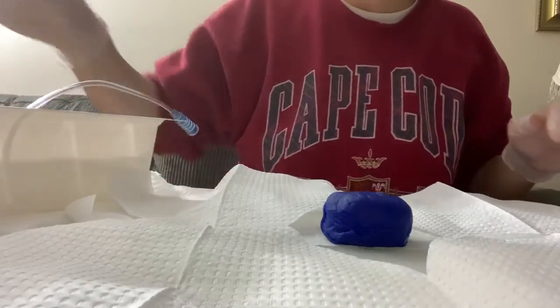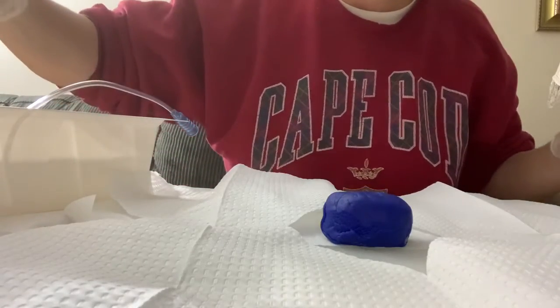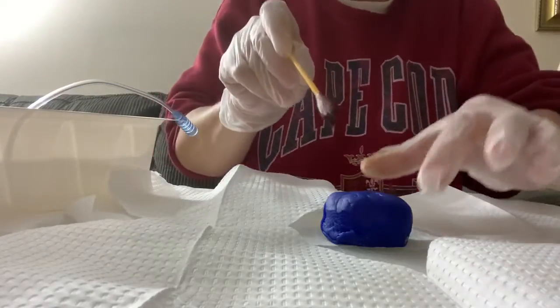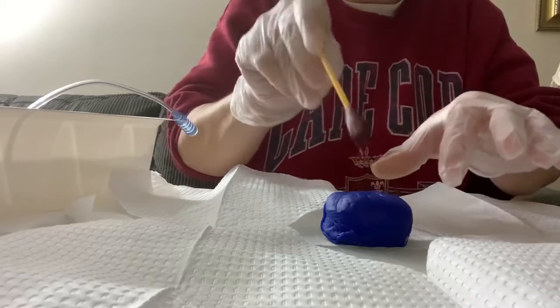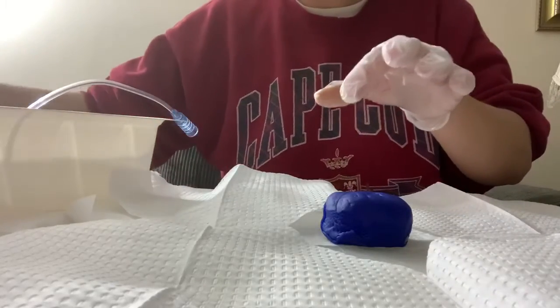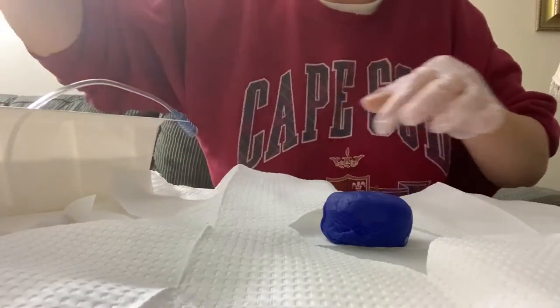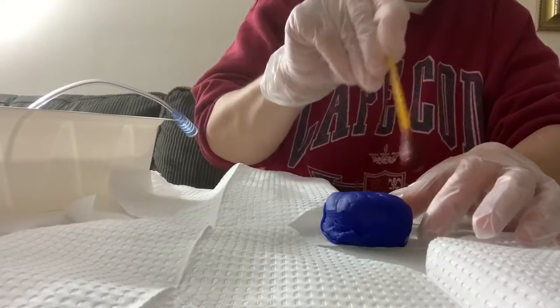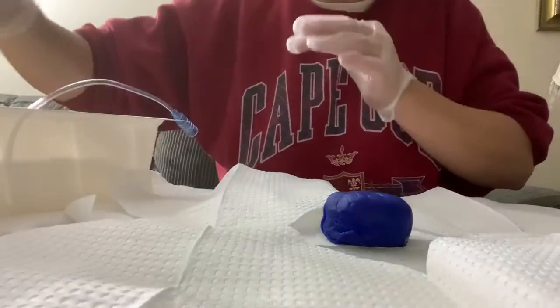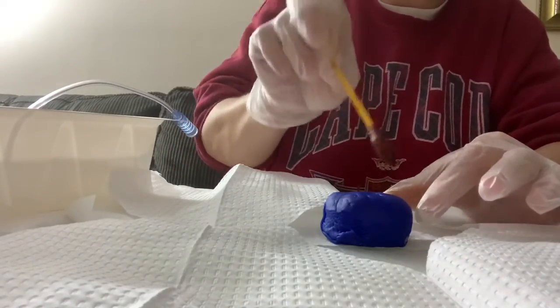First, I'm going to clean the peri area again using the iodine. So I'll take my first swab and clean from one side, front to back. Clean from the other side, again, front to back. And then finally with the third one, I'll clean right down the middle, again going front to back.